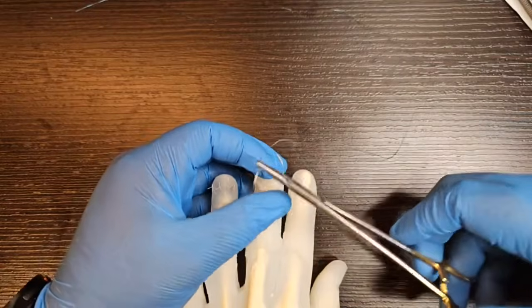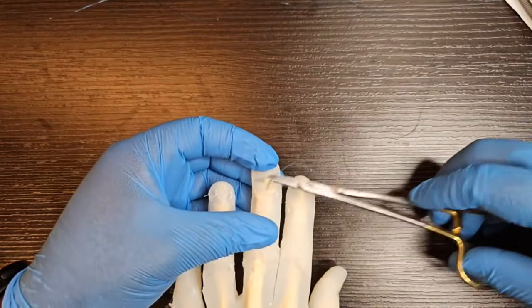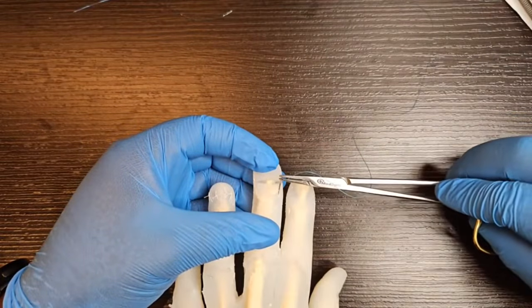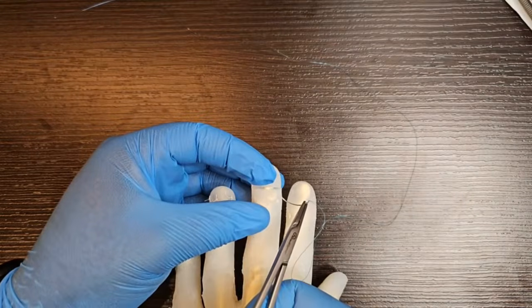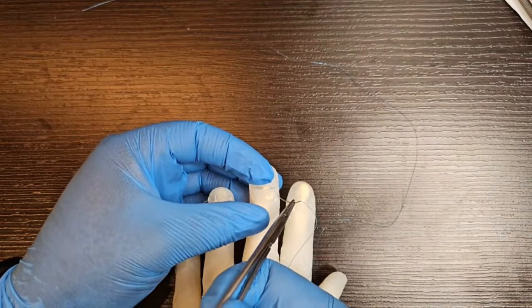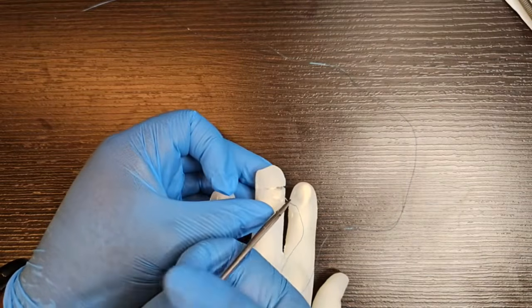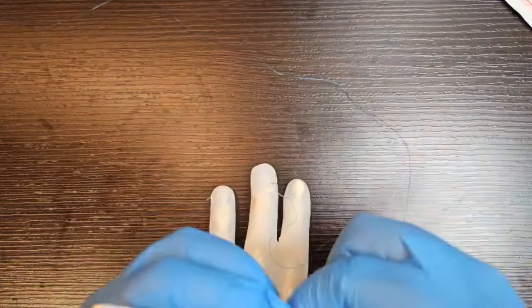Tips for stitching injured fingertips or even skin grafts is you stitch from island to shore. If I suture this way, I'll show you what will happen. So this is from shore to island. This is not correct. And I'll show you why it's not correct.